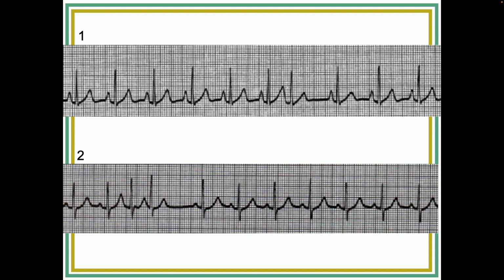Okay, you can pass the pointer on to either Cody or Grace, whichever direction you want to go. Grace, I got it. You'll all get a chance, don't worry. Okay. I got sinus tachycardia. What's the rate there? Let's say you did the boxes method. I didn't do it on this one, I just kind of eyeballed it.